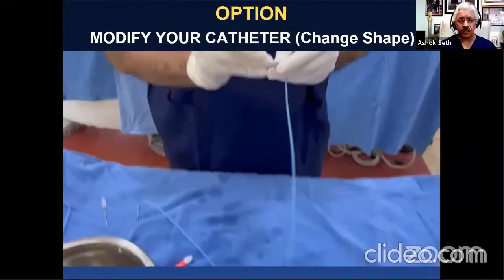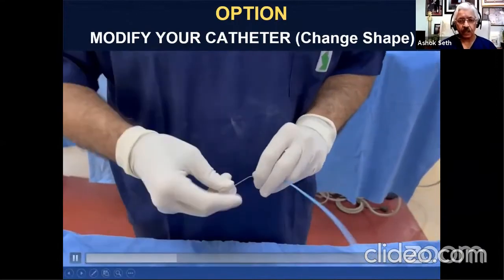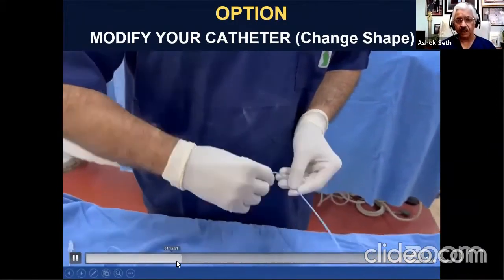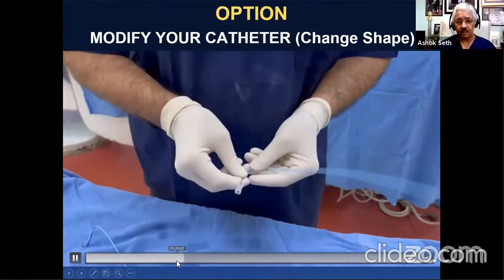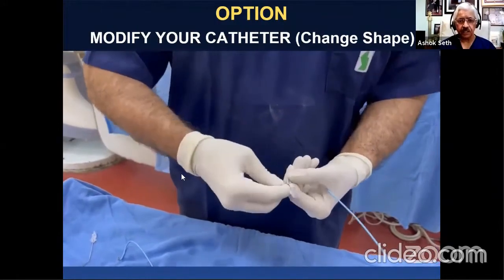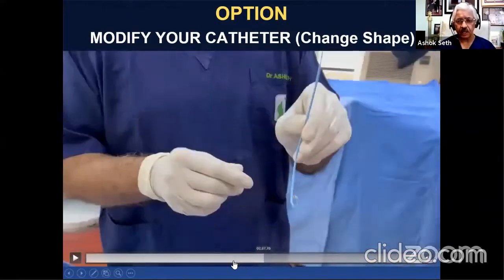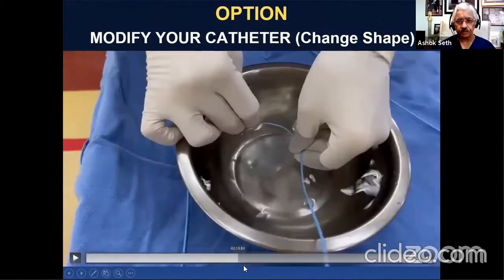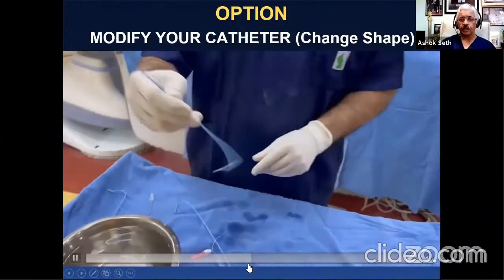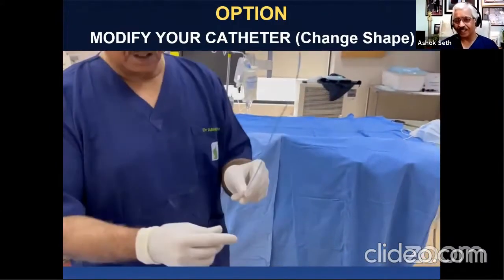With an Amplatz 2, in the same way, I can convert that big curve. I create a very big curve and then decide to turn it anteriorly. So I can decide anything. And then look what I get. I get a huge loop, and now I've got something like an Amplatz 6 pointing anteriorly.